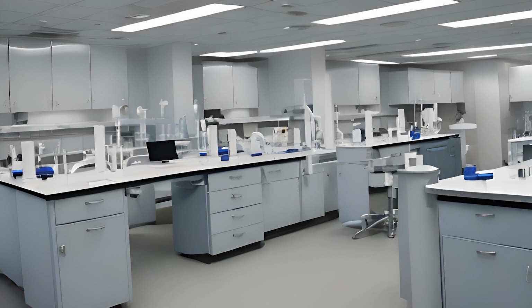Your first step is going to be review and accessioning your test request. Legally, a blood collection procedure is going to start with the test request from a physician or other qualified healthcare provider, such as a physician's assistant or a nurse practitioner. Accessioning your test request is the process of recording that request in the order you receive it.